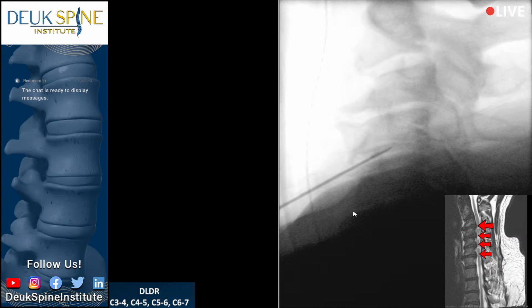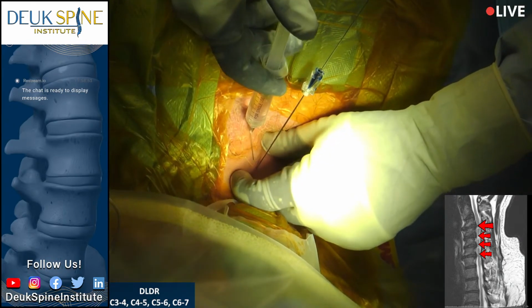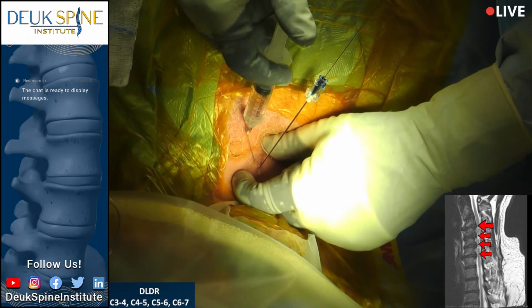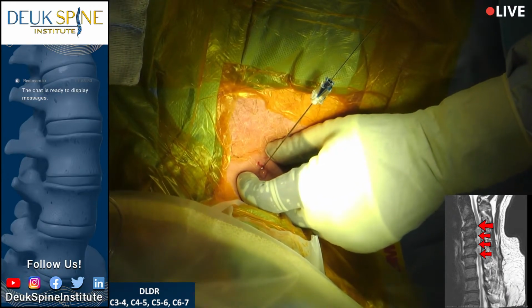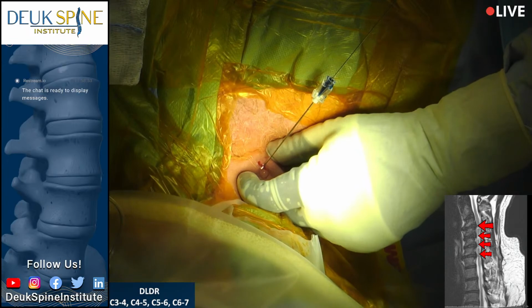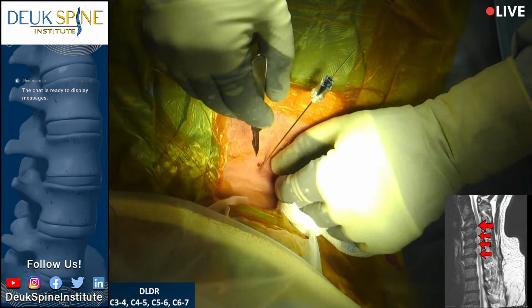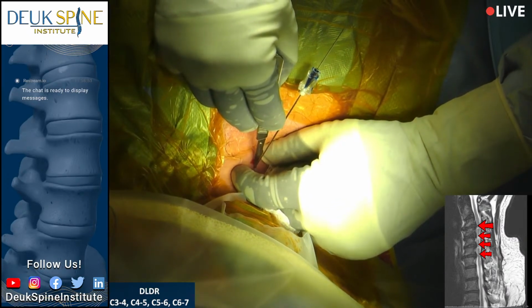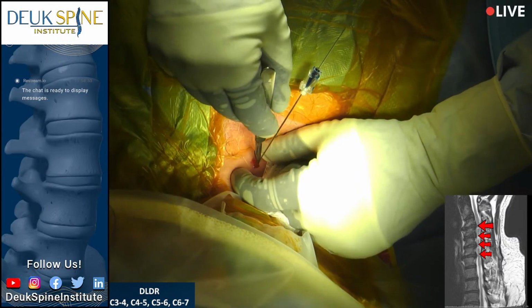All right, so guide wire's in. We'll make our incision. Going to give him a little numbing medicine first to numb up the skin. Blood pressure's good. That's perfect. Why is that sticking to my hand? You got to watch those labels. I'm glad you're labeling everything. The incision is 4 millimeters for the surgery. It's a small incision.